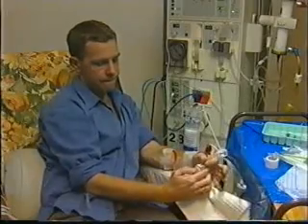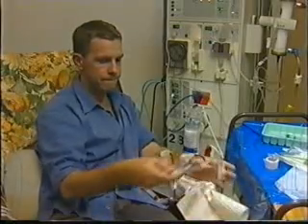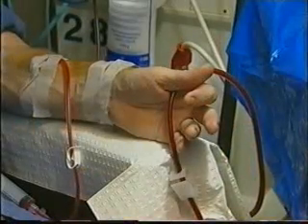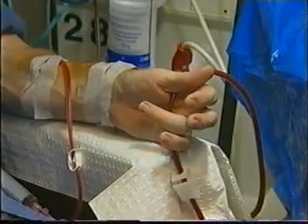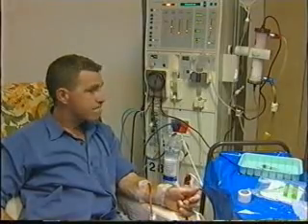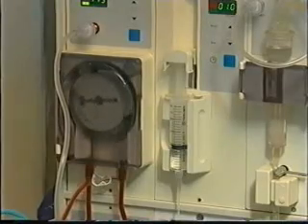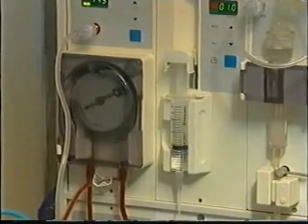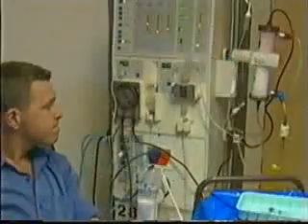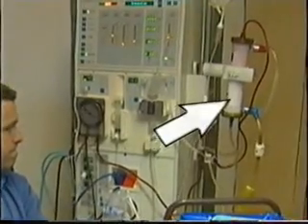Let's show you a machine again. First, we'll follow the tracks of the blood. The needles take blood from the person to the machine and back again. This pump pushes the blood around the machine. Rubbish blood comes up to the filter and is cleaned.